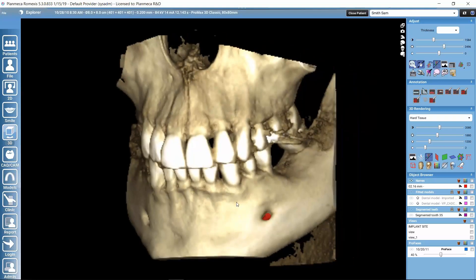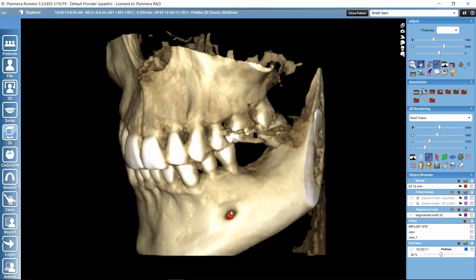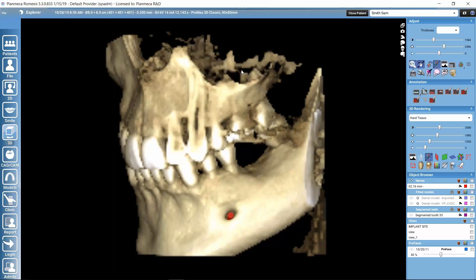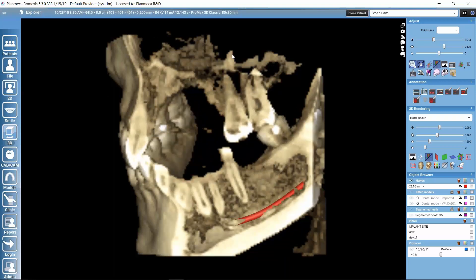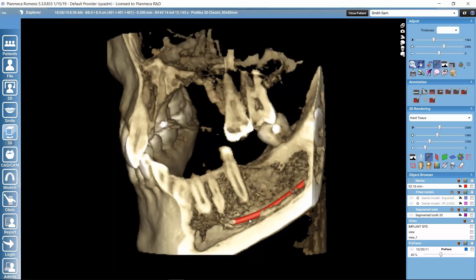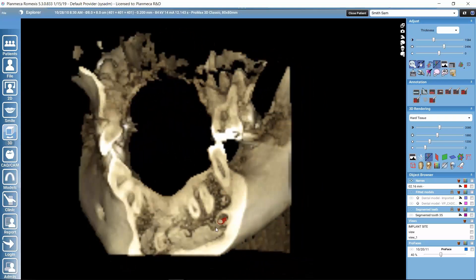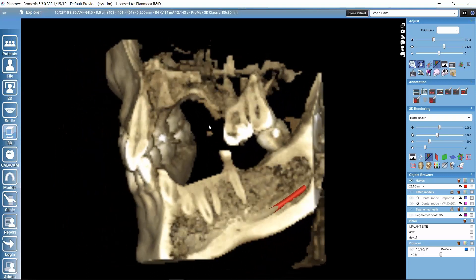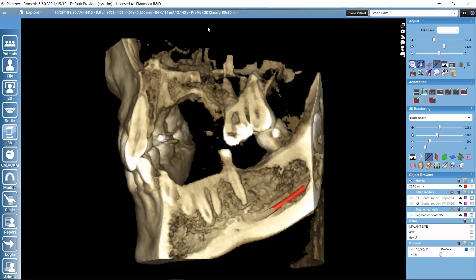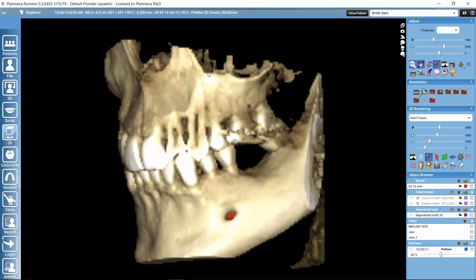To crop the volume and see what's inside, keep the right mouse button down and move the mouse from bottom towards top. This crops the volume so you can see the nerve canal, roots, and any objects like implants. Moving the volume around preserves the cropping level. To reduce or close the cropping, keep the right mouse button down and move the mouse from top towards bottom.